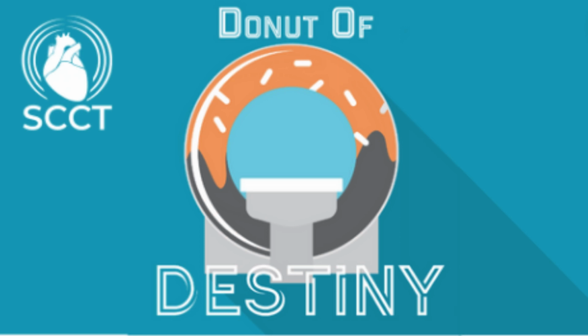Yeah, so the second paper from Brian talks about absolute time delays, and how absolute time delays from the R wave are much better than a percent reconstruction, because with beat to beat variability, first, your diastole changes a lot, and systole changes much less. But even with systole, if you are using percentages, then your different heartbeats won't line up perfectly.